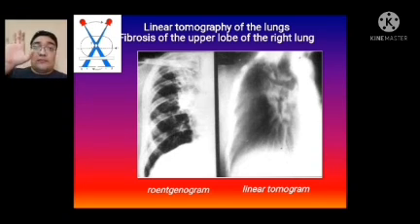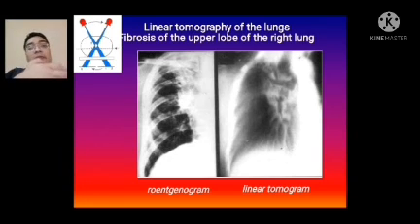But we need only, for example, one part, right? We can take only this part. Still, because the patient takes the radiation for a long time, it's much more harmful compared to X-ray, but it gives more information. For example, in some cases X-ray can show inflammation of the lungs in 30, 35, 40% of the lungs, while CT scan can show 60, 65. So it's much more accurate compared to X-ray.